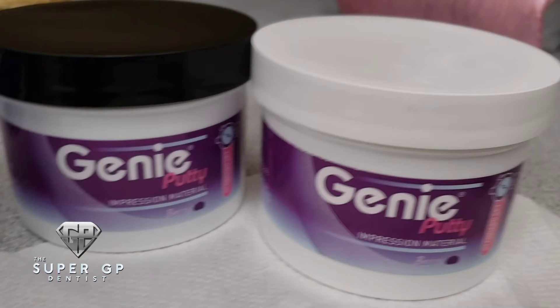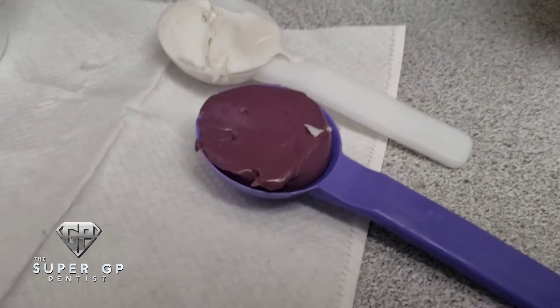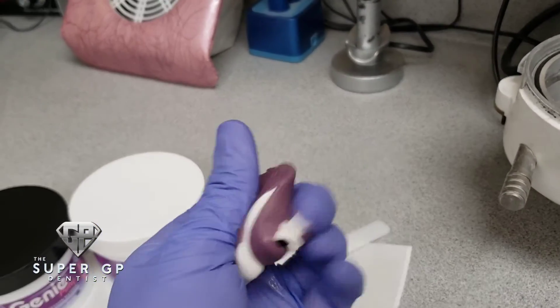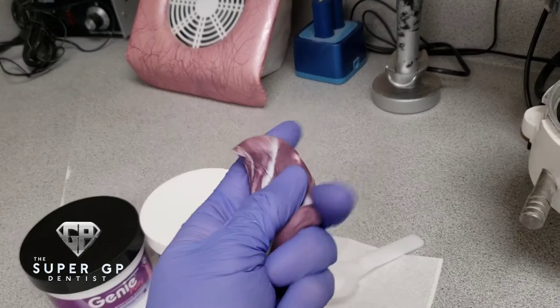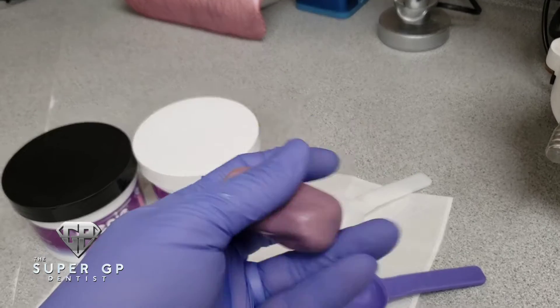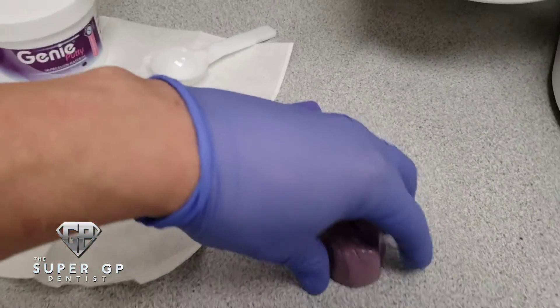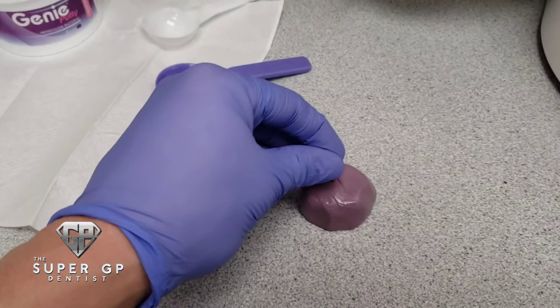The material I use to create the custom impression coping is Genie putty. It's a fast-set PVS material with a one-to-one mixture. Here you can see me mixing it with one hand — you want to make sure you get a good consistency and that all the colors blend together. I create a little block, actually a small cube, so I can fit the temporary with the lab analog attached to it.